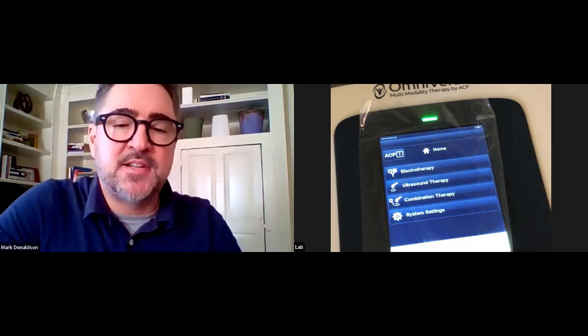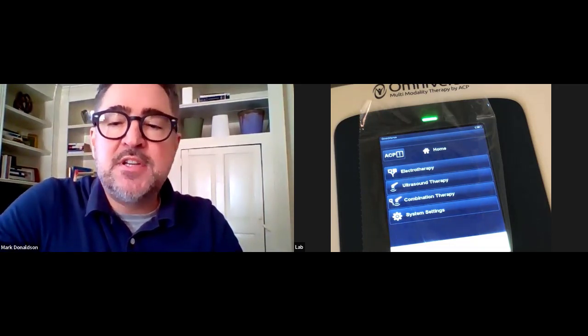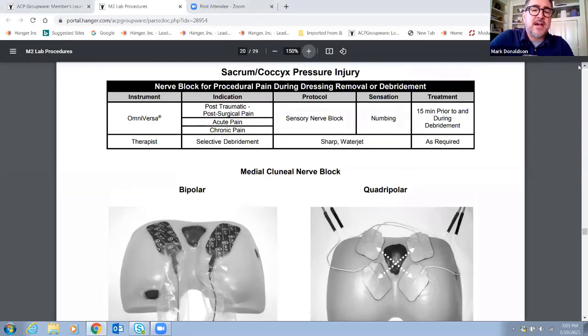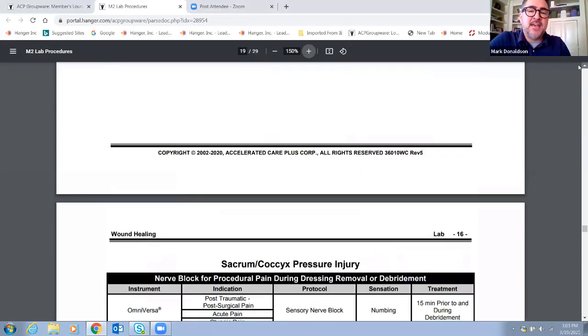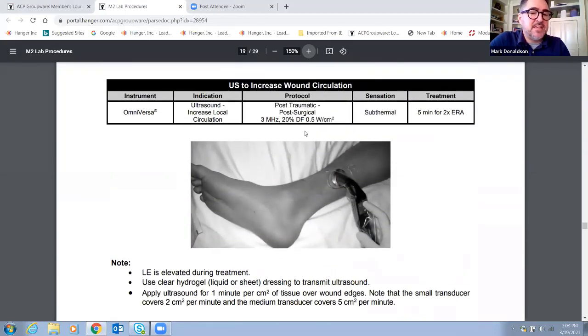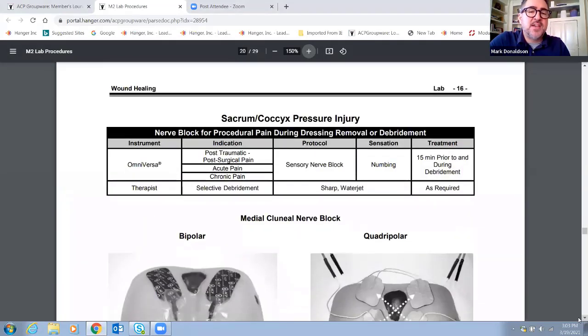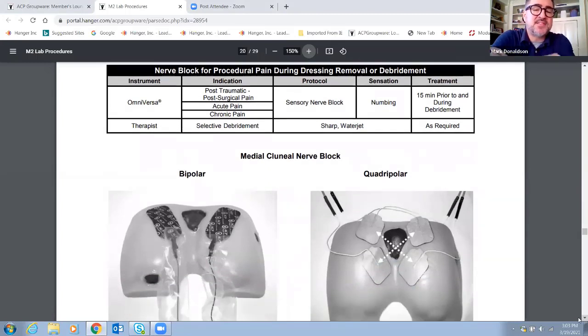I'm going to share my screen first. I'm doing a screen share to find some of the resources we're using for today. I'm going to point out the ACP clinical solution for wound healing — I pulled this from the lab section. So if anyone has a clinical solution for wound healing, this would be in the lab section. I'm going to go forward to sacrum coccyx pressure injury, and this is the setup.